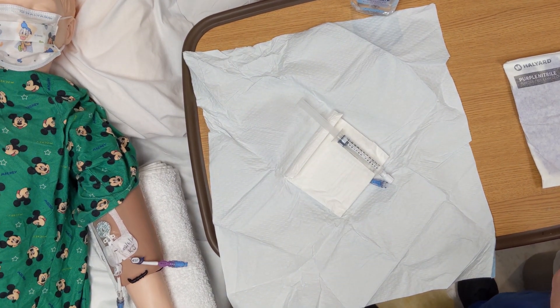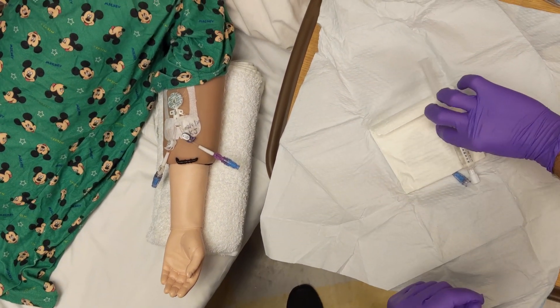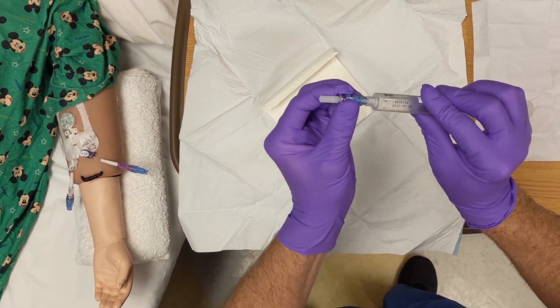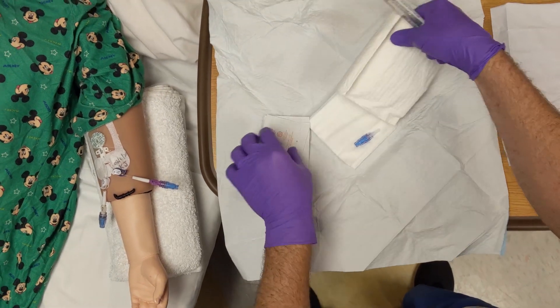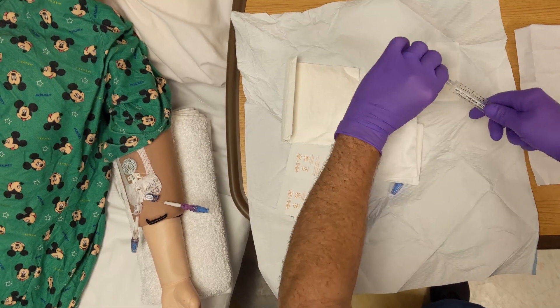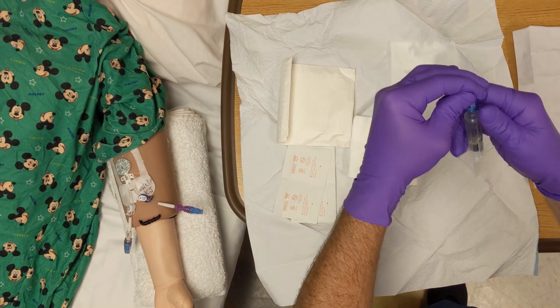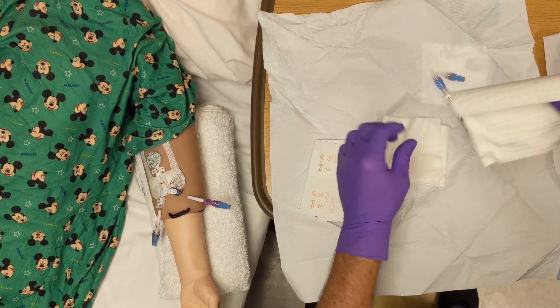Don sterile gloves. Open all packages of alcohol and place them inside the sterile field.